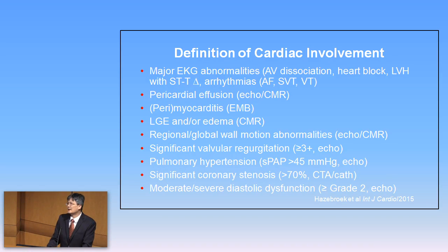We have actually spent most of our efforts now using MRI because it allows better tissue characterization as well as fibrosis evaluation. And late gadolinium enhancement, with increased signals, does occur during inflammatory response, both at the pericardium as well as the myocardium.